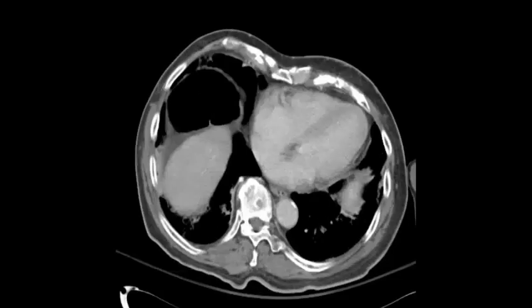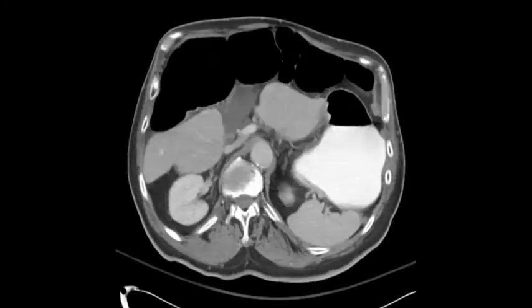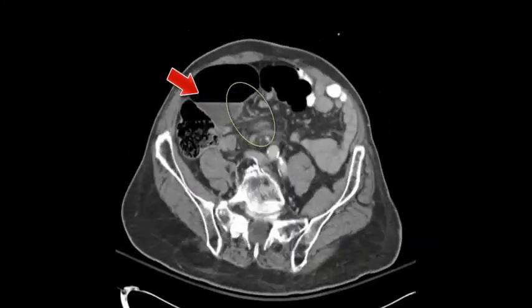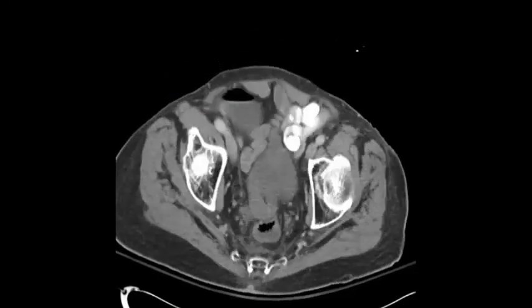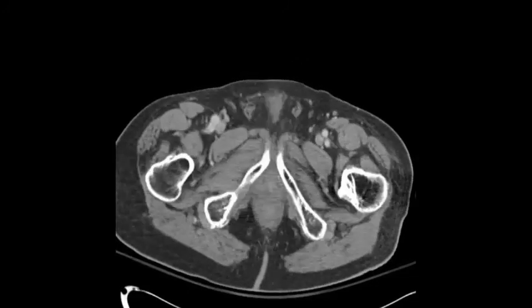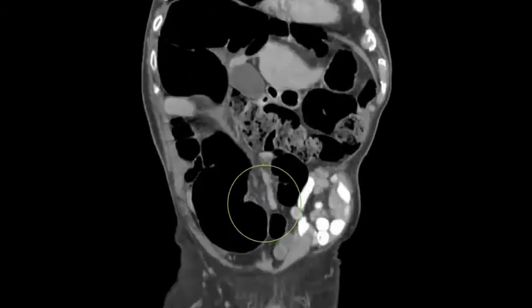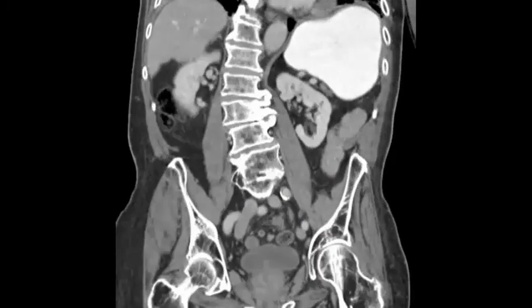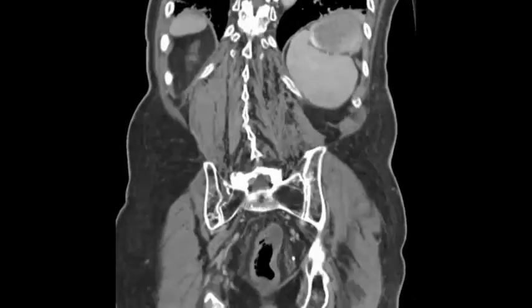Here's the axial cineclip — just pay attention to how subtle the mesenteric twist can be when evaluating a single plane. There it is highlighted in green — pretty subtle on only a few slices. I want to stress how important the reformatted images are. The coronal views more clearly show the twist of the sigmoid mesocolon, which is the classic appearance of sigmoid volvulus on CT.